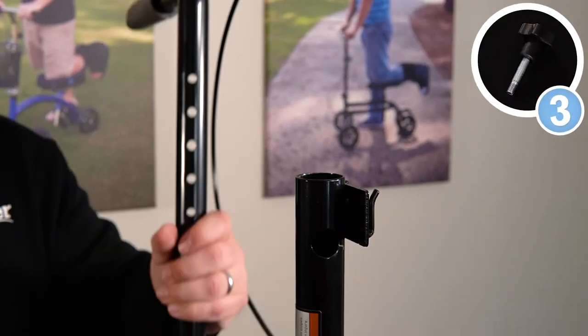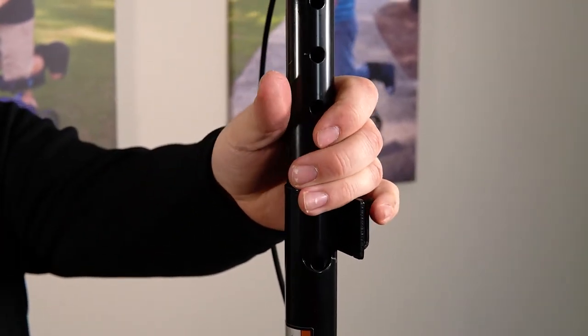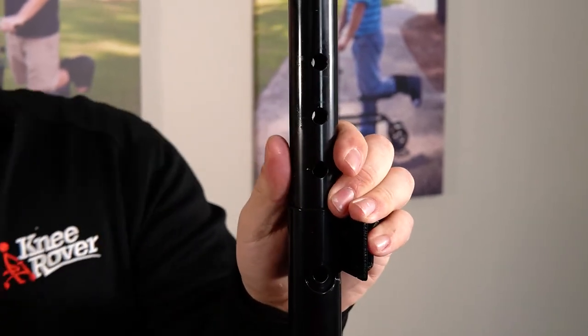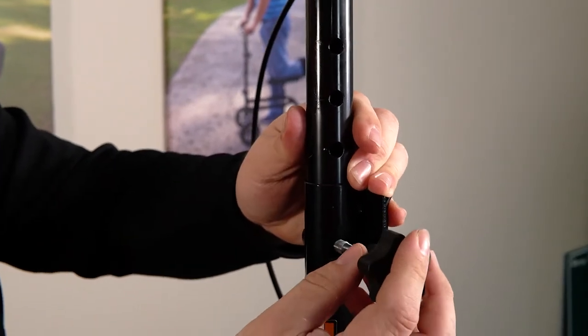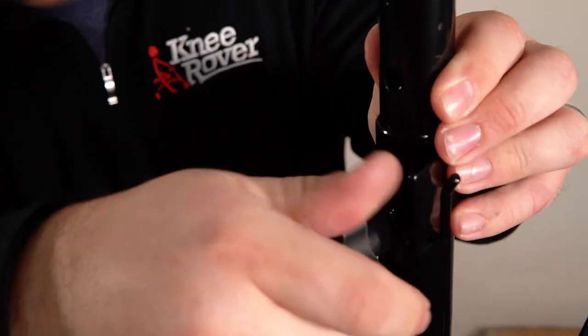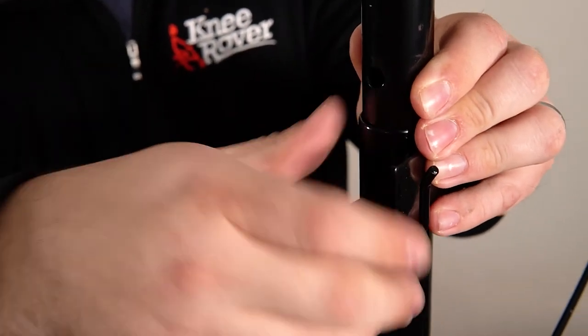Alright, so step number three, we're going to start the steering column into position, and then we're going to take your height adjustment knob and screw it in here at your desired height. Make sure you get this really secure.